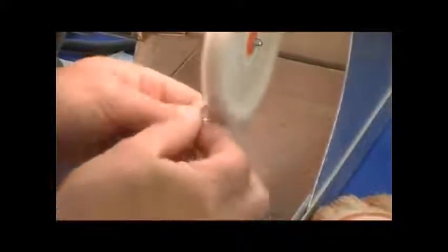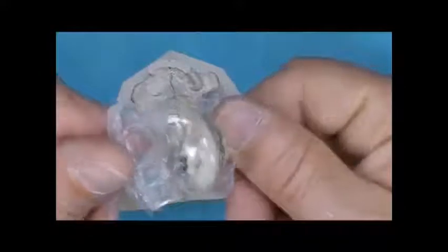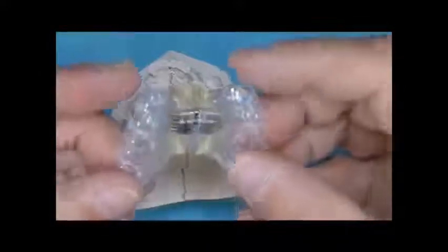Once polished, the appliance is scrubbed clean with liquid dish soap and warm tap water. Then dry appliance. Finally, close screw to original position. Insert key into hole and activate towards front of the appliance. Seat the appliance onto the model to ensure fit.